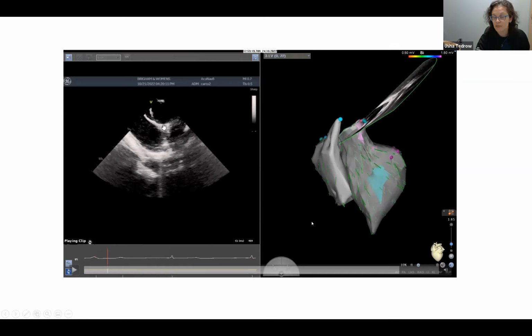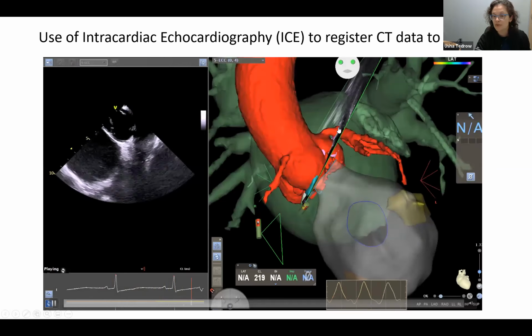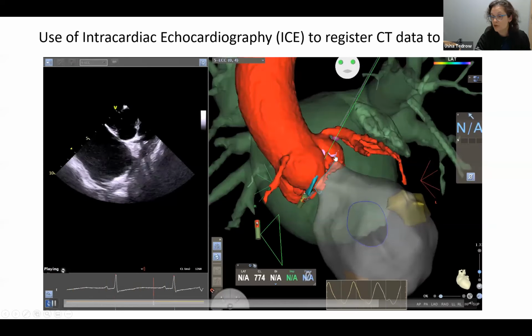This is the left main before it joins up with the left coronary cusp. You can get all the cusps. I always say that they're a little bit like a cup, so you can make slices of them going up and get a geometry of each of the coronary cusps. And then to register with the CT image, this is just a plain CT.